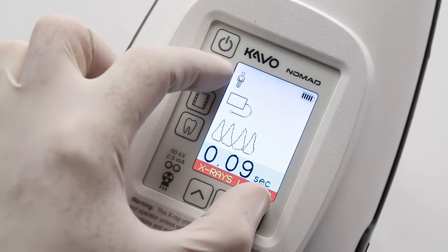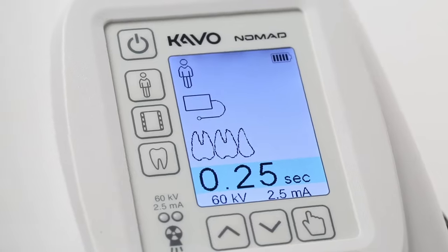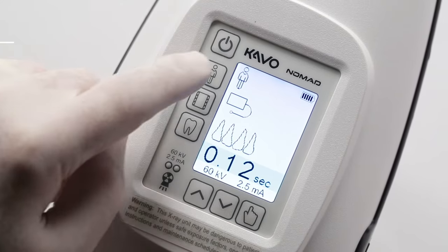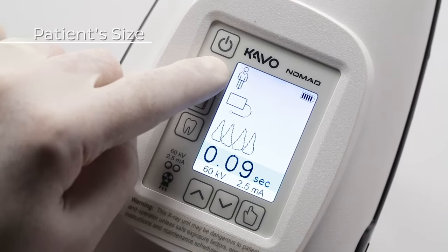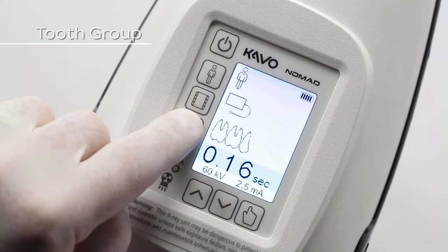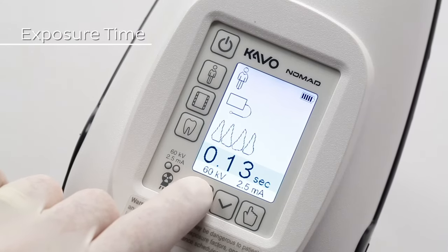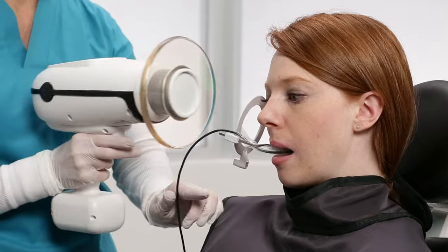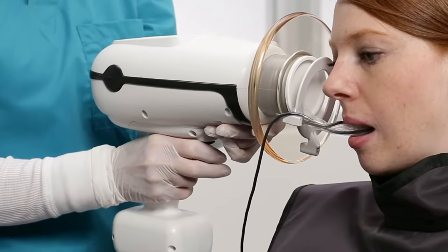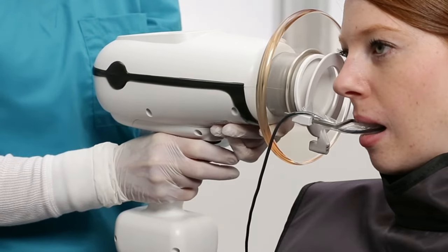Repeat the process to unlock the X-ray feature. Before taking an X-ray, there are a few safety features you should know. First, determine what settings on the Nomad will deliver the optimal results for the patient. This includes the patient's size, image receptor type, tooth group, and exposure time. As a safety feature, you must first enable the device to create an exposure. To do this, you must pull the trigger once and then again to make your exposure.